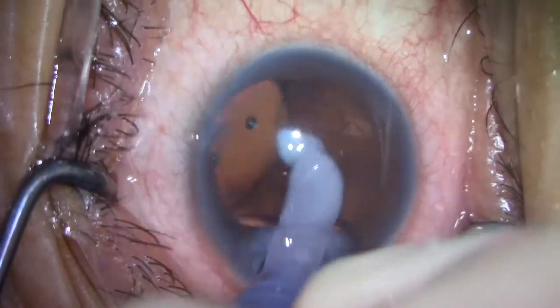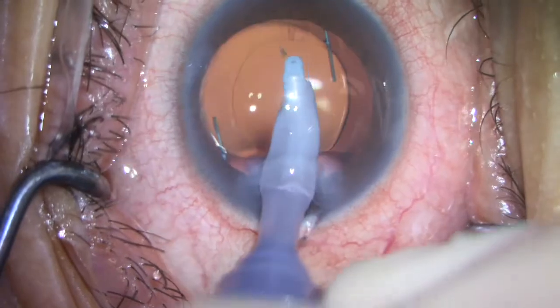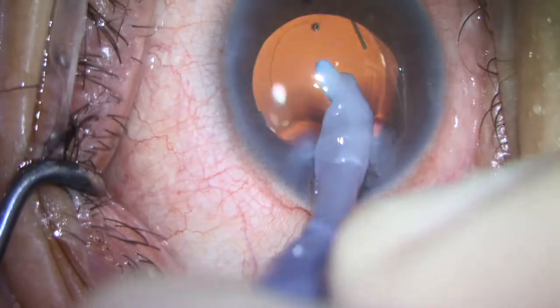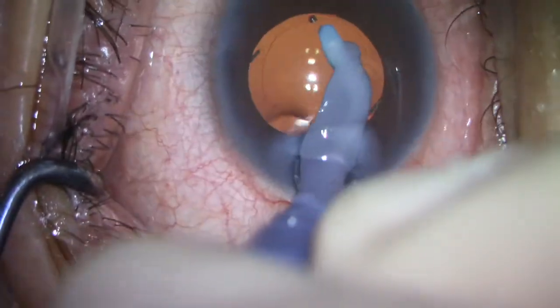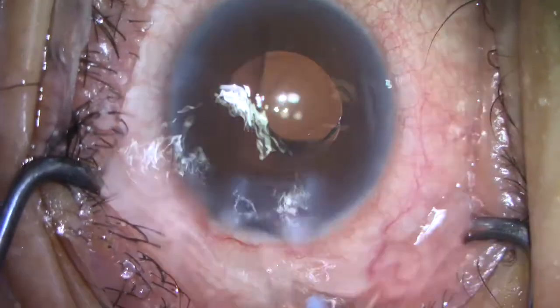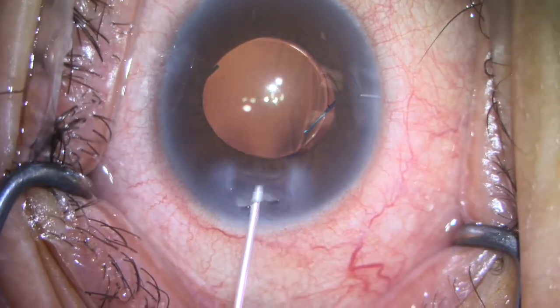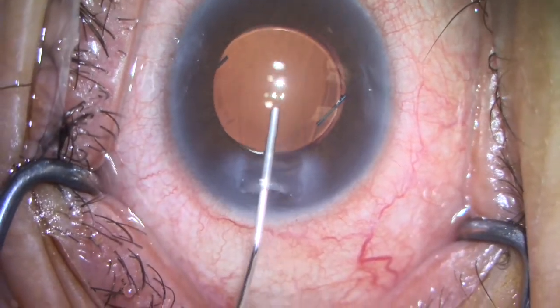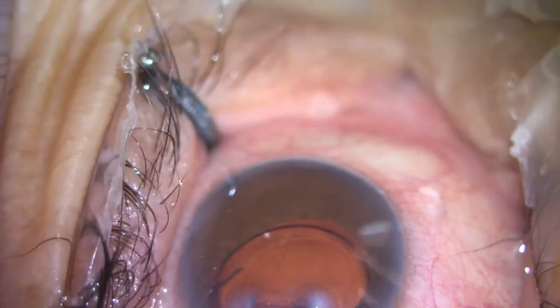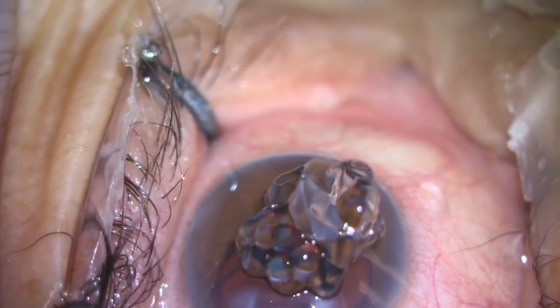I do like to perform cleanup of all of my viscoelastic from behind the lens prior to placing my Cypass device. I basically clean out the entire anterior chamber of NuVisc, and I prefer to replace it with Helon GV. This gives me a little more depth in the anterior chamber, plus the added benefit that the GV comes out of the eye a little more quickly and easily following insertion.